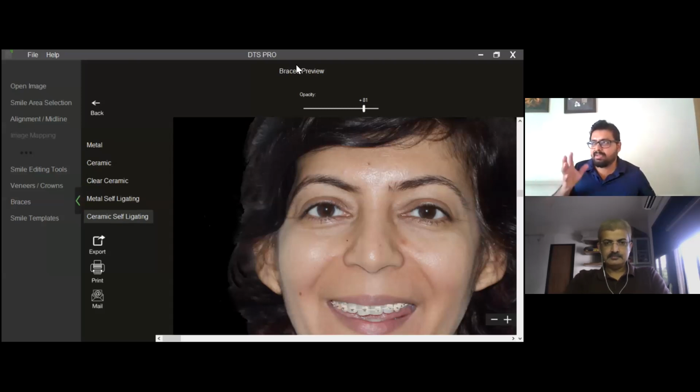So as long as the image is good, it is not pixelating when you are showing it to the patient on a decently big screen, it doesn't really matter what the source is. Are you planning to go 3D anytime?